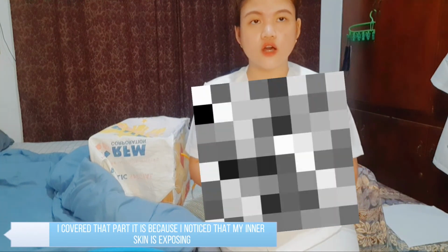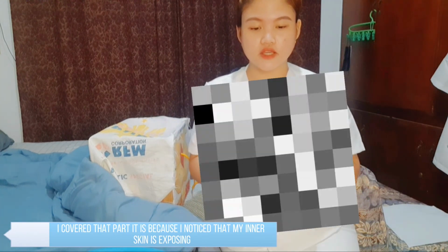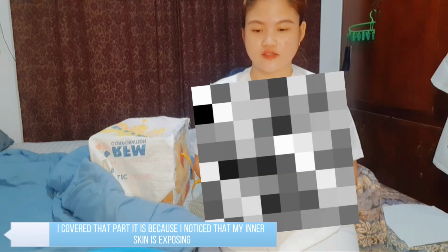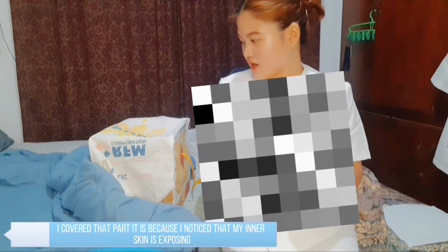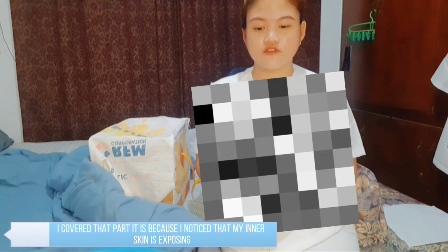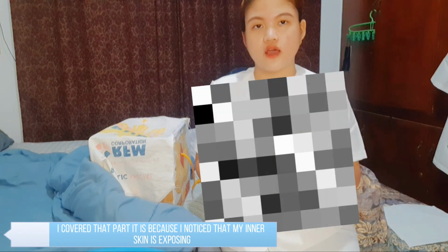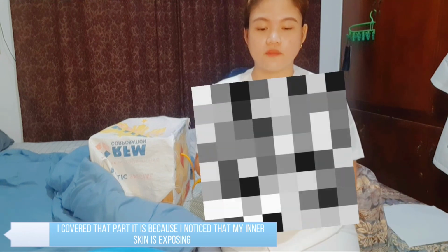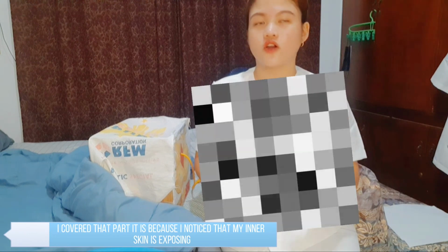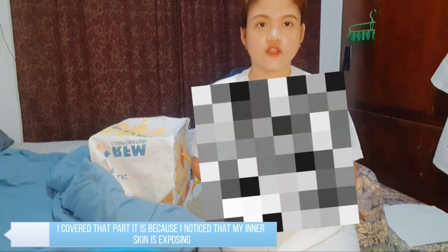In order to place the linen, it is to reduce the transmission of microorganisms, just like washing your hands. So after that, of course, the evaluation: you need to document all the findings after you've done the procedure to the patient, in order to have accurate records for all collaborative management and continuity of care.